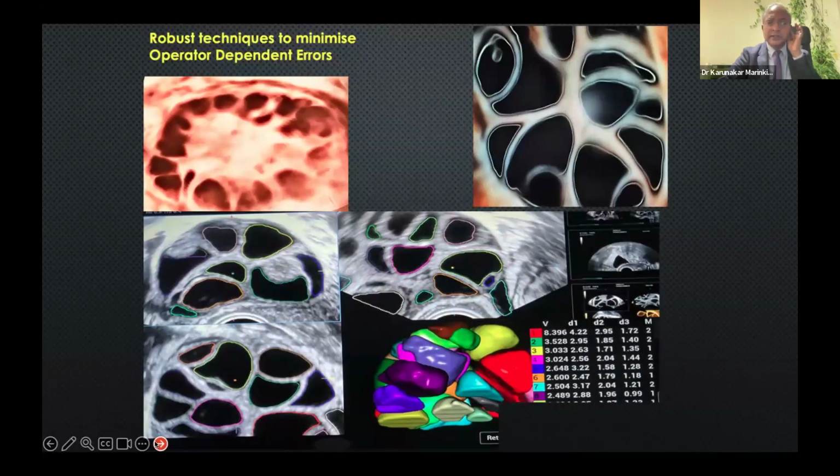We have 2 cases in the last 6 months, medical legal cases I manage here. You don't need 3D, SonoAVC, all that to measure. I say more than 15 follicles, finished. I don't need to write there are 40 follicles, 42, 35. I don't need to.